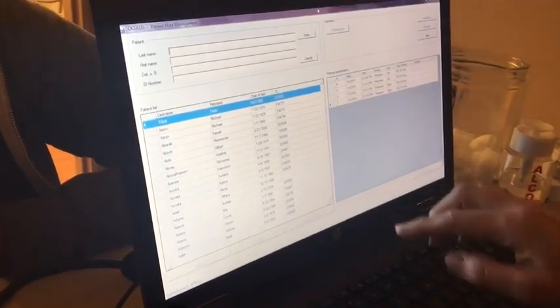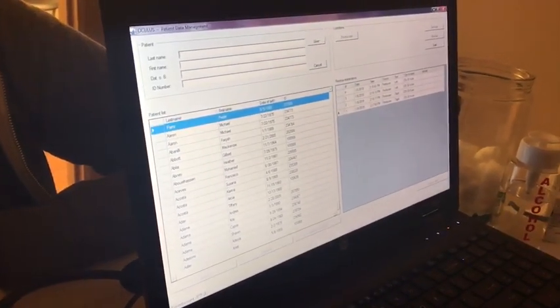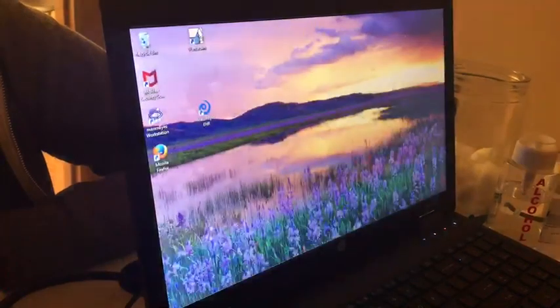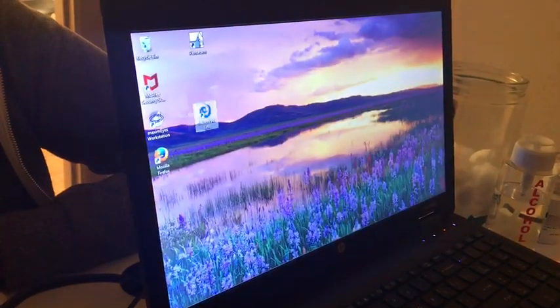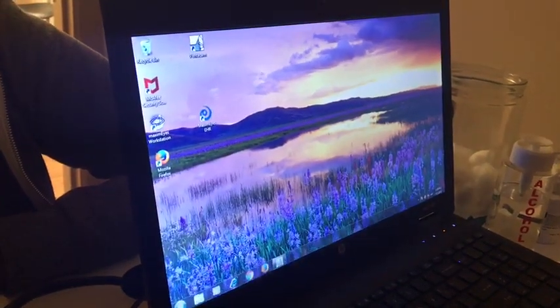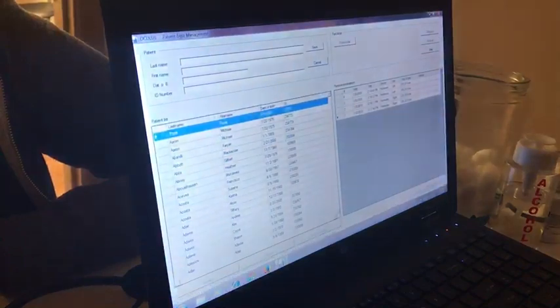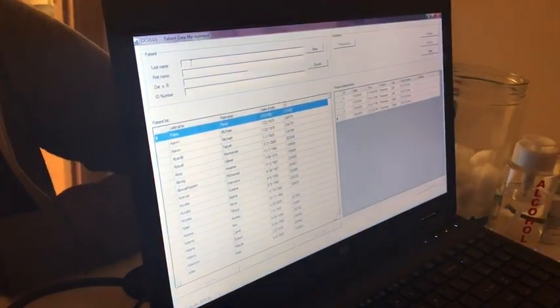This is how you do a PentaCam. First you load your software which is going to be right here where it says PentaCam. Whenever you get it pulled up, this is what you're going to see.